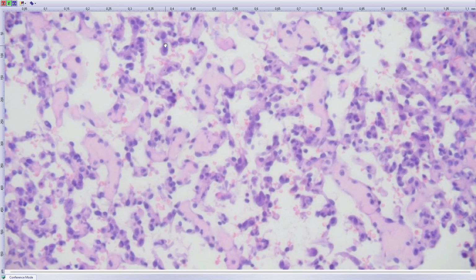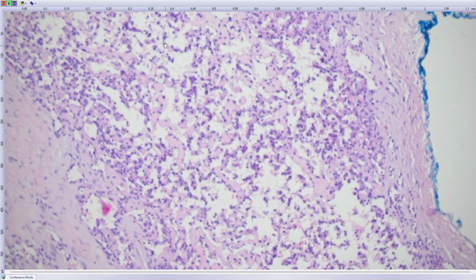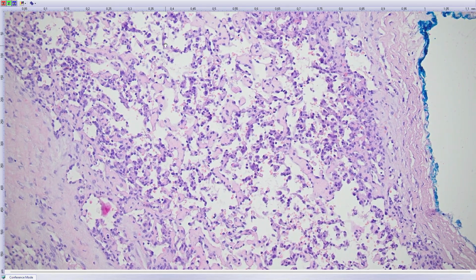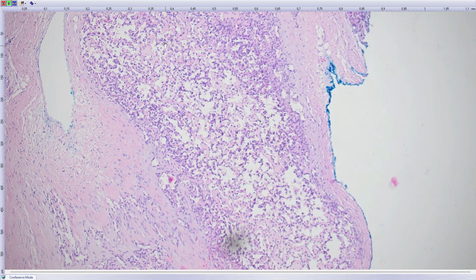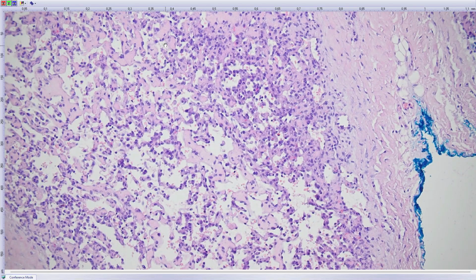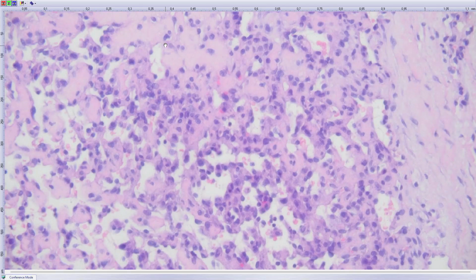Hemangioendothelioma. It's in the differential, hemangioendothelioma, or angiosarcoma, or since we have the thrombus here, it's Masson tumor. Yeah, I think this is the so-called Masson tumor. Today it's called papillary endothelial hyperplasia, and it's basically a form of thrombus organization. So basically, thrombus forms, and then as it's recanalized, the vessels sometimes look this worrisome, and it mimics angiosarcoma.